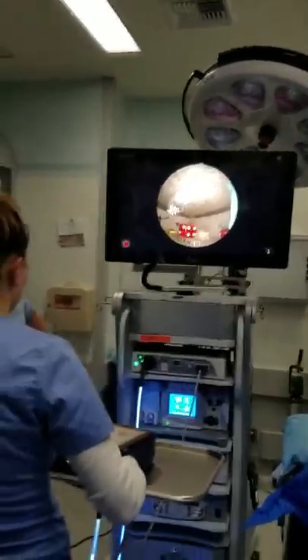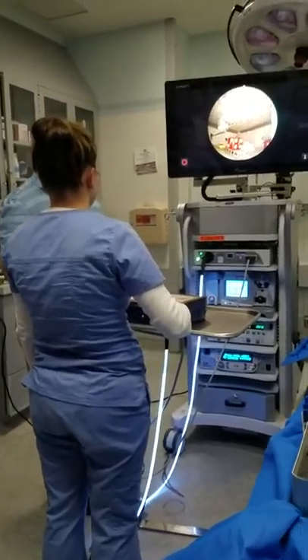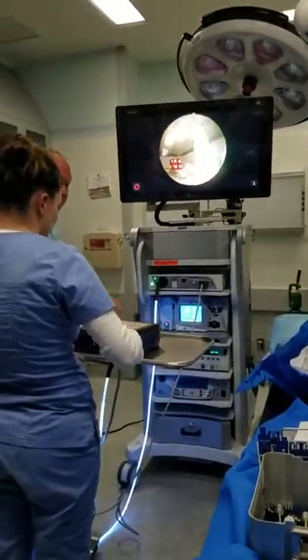And you're going to grab things, put things up, put things around. But the main idea is to be able to find something, follow it, and then be able to touch, twist it to yourself. Because that's going to be important to kind of be able to figure out what you're doing. And slow motion is more important. So, that's not too bad, right? You want to do another hole, just go there and twist it so you can see.